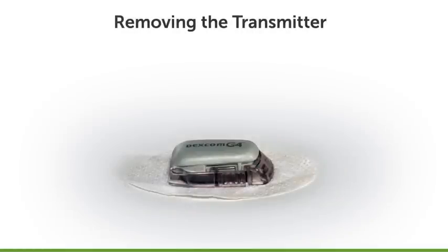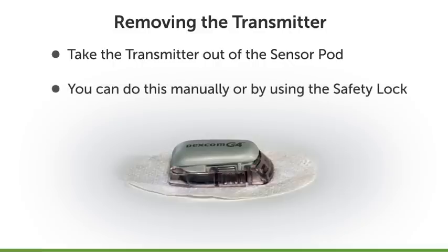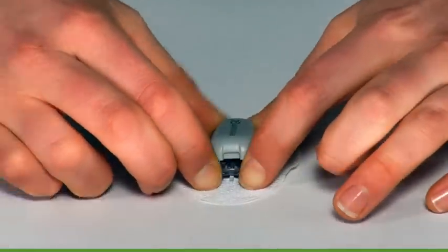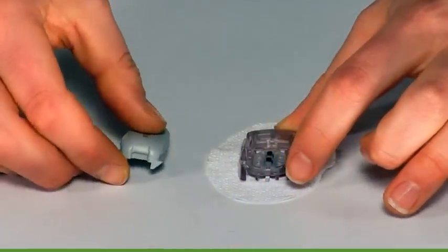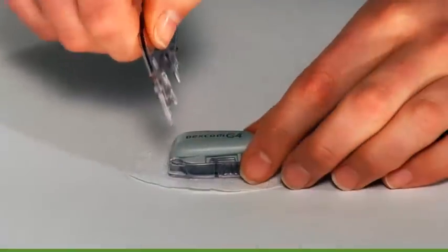Once you've removed the sensor pod and transmitter from your body, you will need to take the transmitter out of the sensor pod. You can do this manually or by using the safety lock. If you did not keep the safety lock, you can use your fingers to spread out the back tabs of the sensor pod, and the transmitter will then pop out.